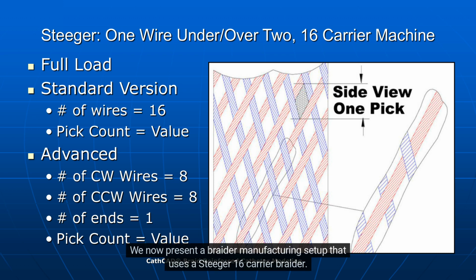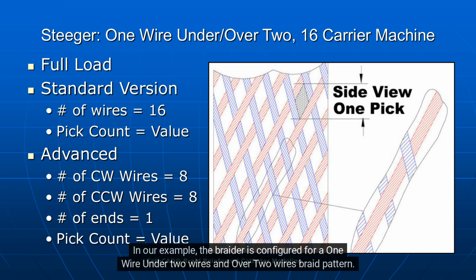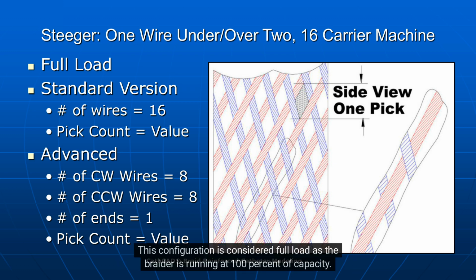We now present a braider manufacturing setup that uses a Steeger 16 carrier braider. The Steeger braiders may be horizontal or vertical. In terms of modeling, the orientation of the braider does not matter. In our example, the braider is configured for a 1-wire under 2 wires and over 2 wires braid pattern. This configuration is considered full load as the braider is running at 100% of capacity.